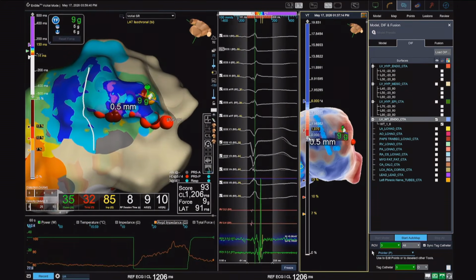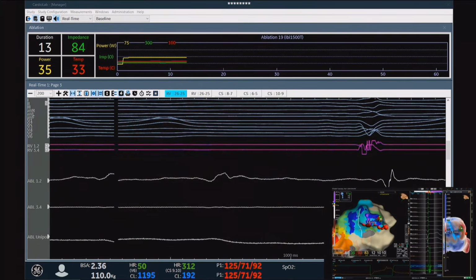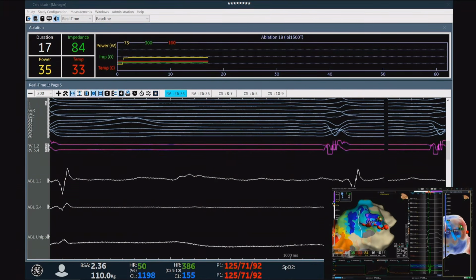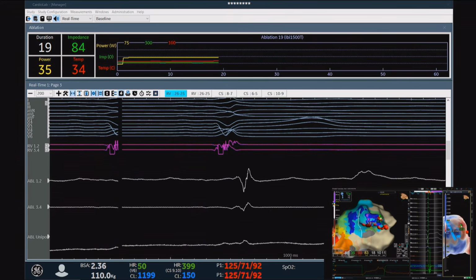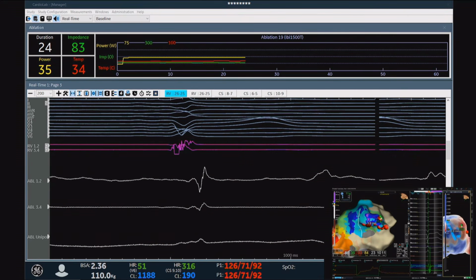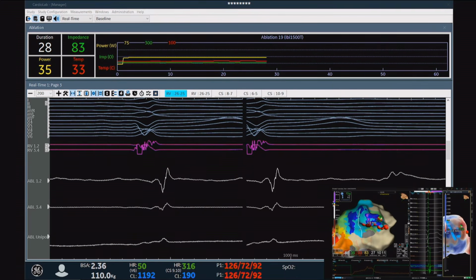Okay, great. Any question right now from the podium? Any question from the audience? Pretty much silent, you know. So that electrogram, that late potential, really went away within seconds, and it correlates well with what you see on ADAS. It's a 1 to 2 millimeter myocardial thickness there. That is what you expect.